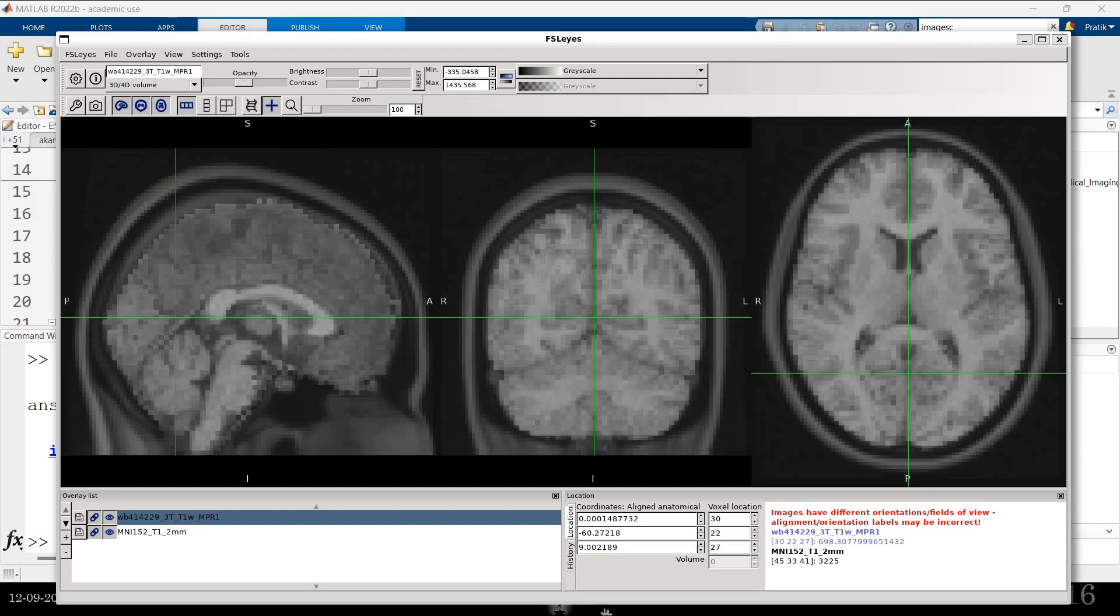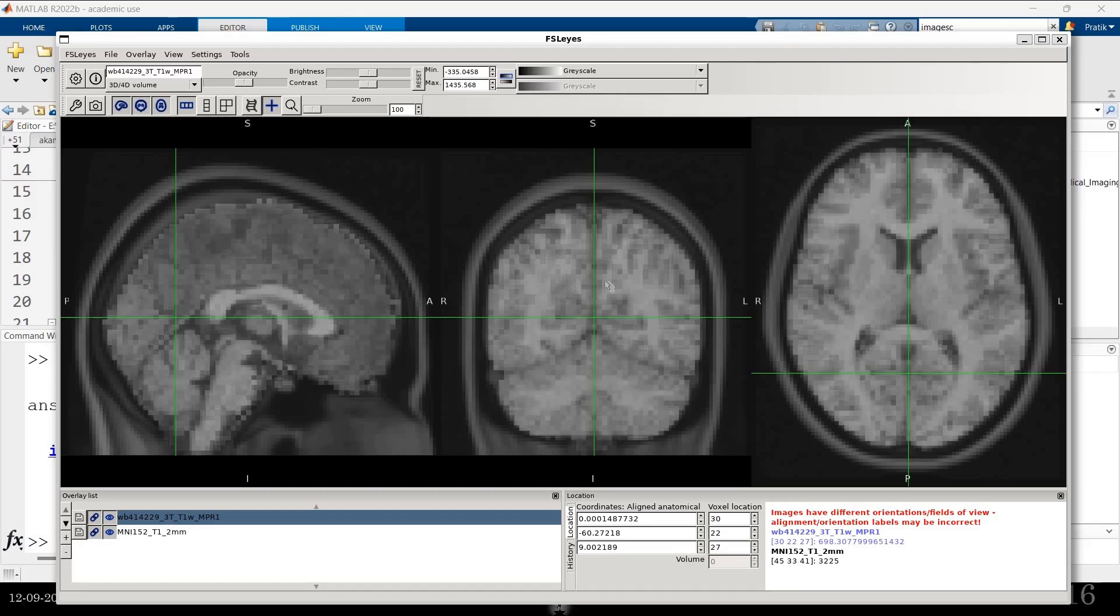But because I have that transform, this FSL software is built such that it reads the transform and then aligns the image according to that transform matrix. So that both of them have shared the same MNI coordinates or share the same space.